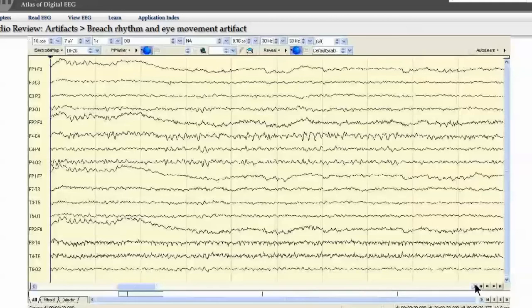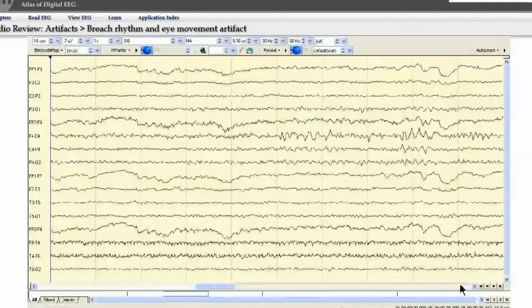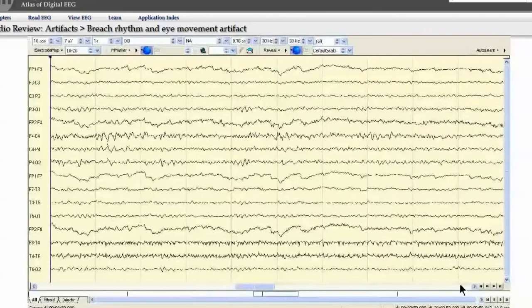As we go towards the end of the recording, we can see these patterns wax and wane and alter slightly with wakefulness and arousal. At the bottom, the slightly spiky and somewhat arcuate pattern is really a superimposition of muscle artifact firing at the T4 electrode.